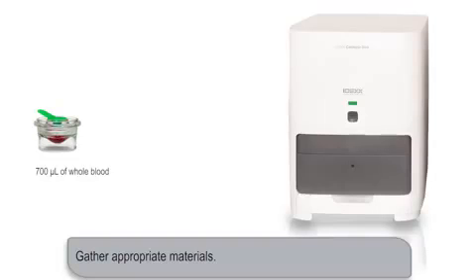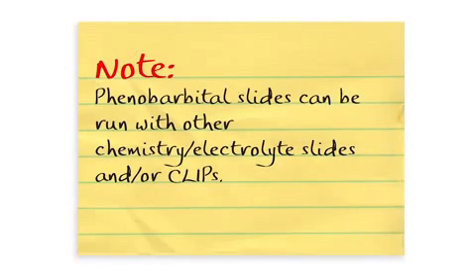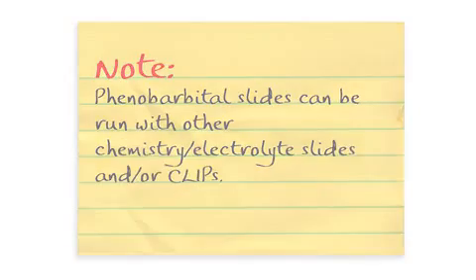To run a phenobarbital test, you'll need a patient sample, which can either be 700 microliters of whole blood in a Catalyst lithium heparin whole blood separator or 300 microliters of plasma or serum in a Catalyst sample cup. You'll also need pipette tips, a phenobarbital slide, and phenobarbital slide wash. Note: phenobarbital slides can be run with other chemistry and electrolyte slides and/or clips.